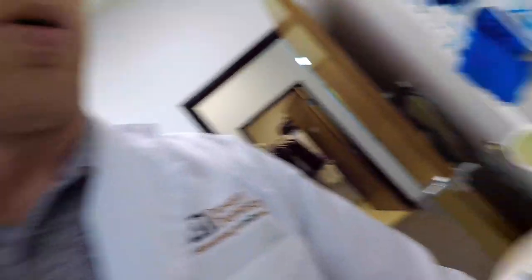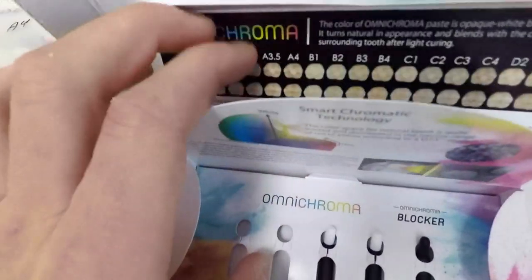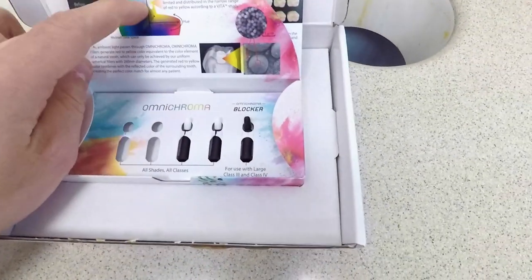When you open the packaging, it's pretty cool — a little box here. It says it uses their smart chromatic technology to get that one-shade-fits-all, especially for their Class 3s and Class 4s.